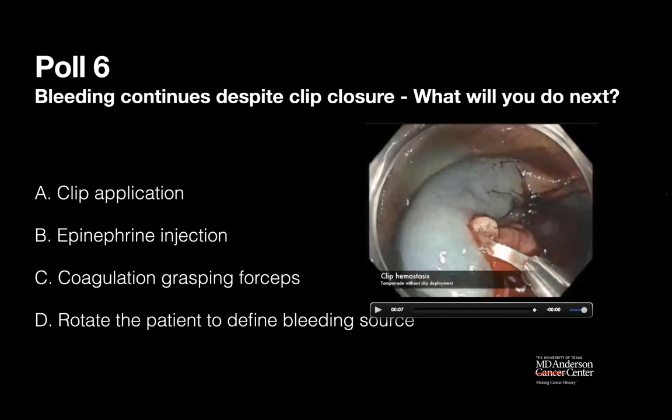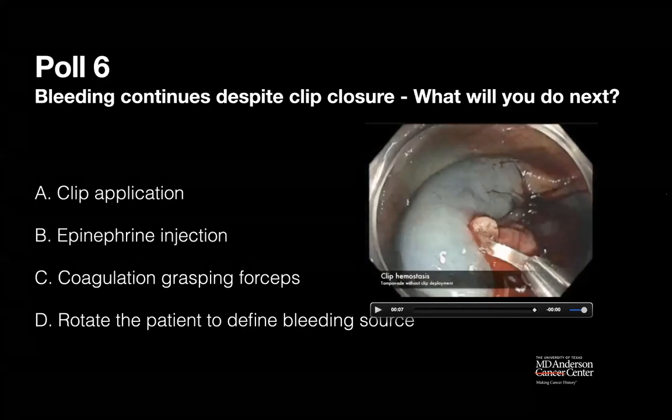And then I made it a point that all my EMRs will be done under general anesthesia, even to the point of paralyzing the patient, especially if I have a lesion in the transverse colon or in the hepatic flexure, because that area could move quite a bit with the respiratory movements. So that has certainly helped. So figuring out how to keep the colon still is very important. I'm glad that we talked about it. It's a very important point for the sake of trainees.